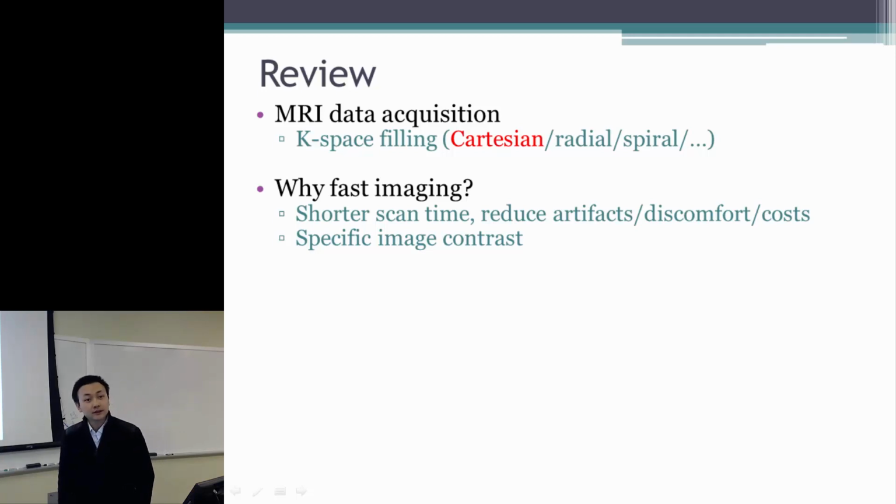So in fast imaging, do we acquire the data quickly or acquire less data? Well, if you only talk about fast imaging, both cases would apply. Even collecting fewer phase encoding lines will possibly alter the image contrast.